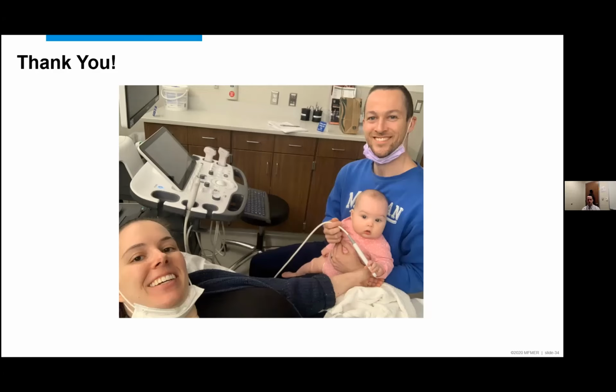After my radiocarpal joint, I'll flip back quickly and look at the distal radioulnar joint. And after I do that, then I go into my dorsal wrist tendon evaluation in the same way that you did. Again, finding Lister's, then I'll slide all the way radial over to the first compartment and just start my scan there and do it in a very protocolized and structured manner.